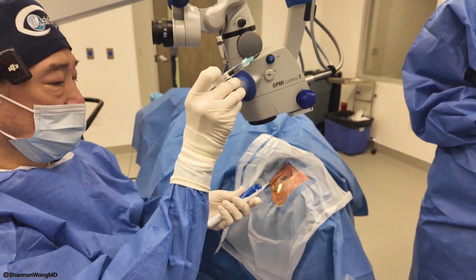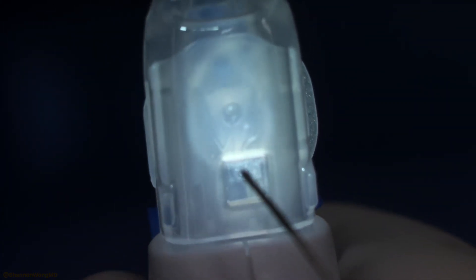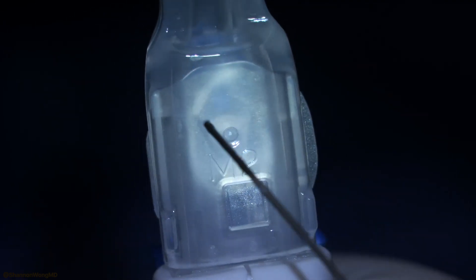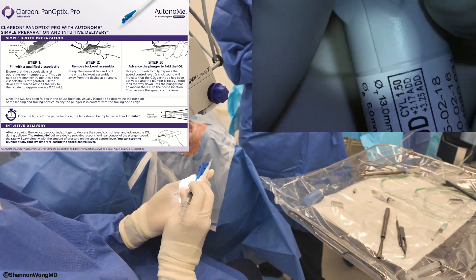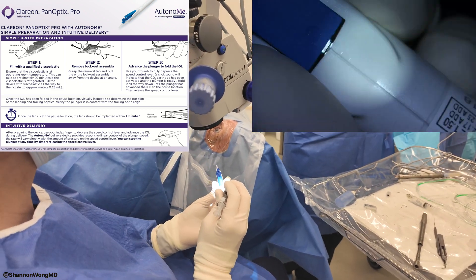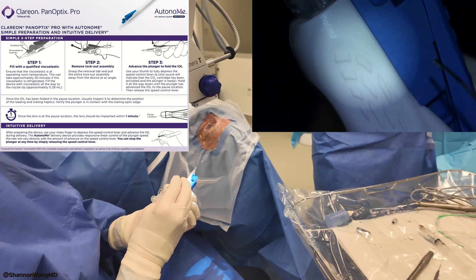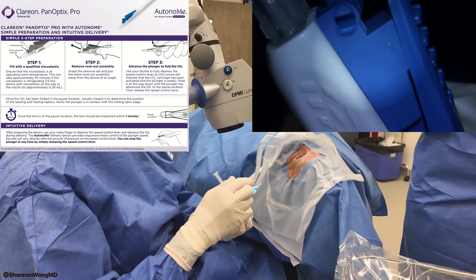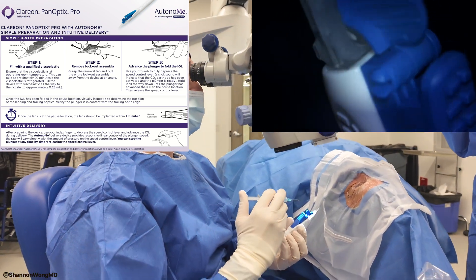So I'm going to go underneath the microscope. Right in there — you can see the haptic. This is what it looks like through the microscope. Here's our handle that we're going to depress. This is going to come out. This is to prevent this handle from accidentally discharging the CO2.